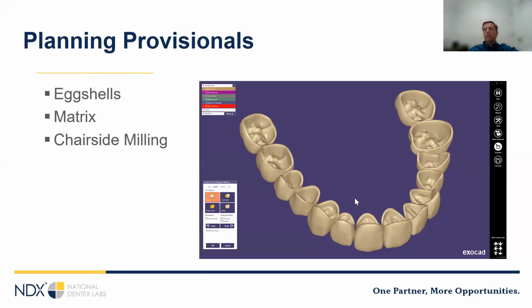And the other thing is that it's very difficult, you'll find, I think, to prep to one of these. You'll try to seat it and it wiggles. It's really frustrating. You can make reduction guides and different things like that to make this more predictable. But just keep in mind, this makes the outside of the restorations look good. It makes the occlusal scheme good. But boy, fitting this can be a bit of a challenge. So just know you're getting into that.